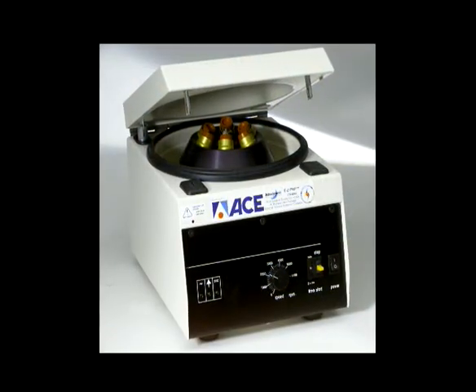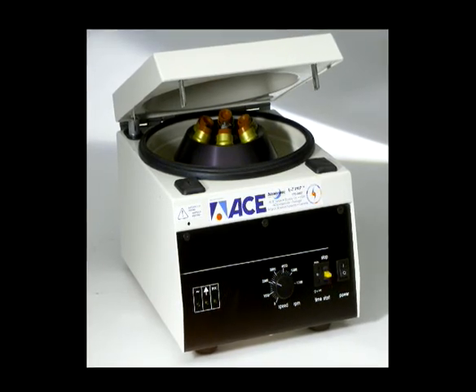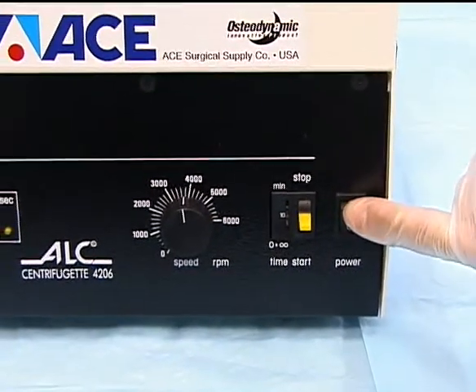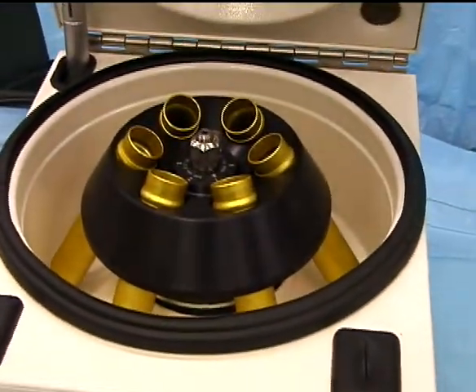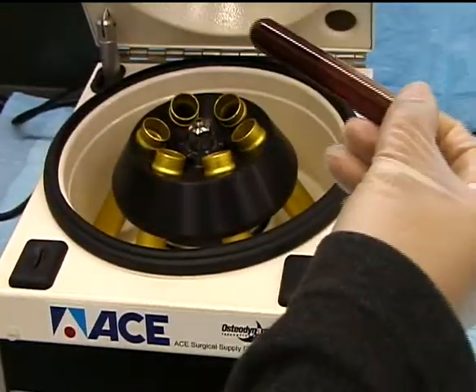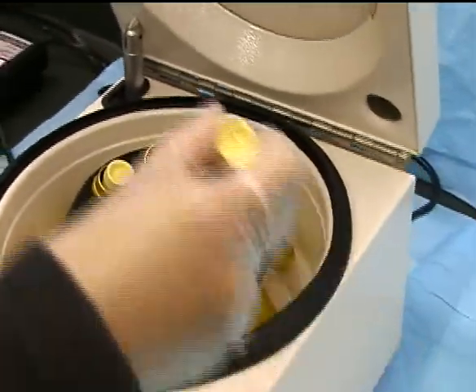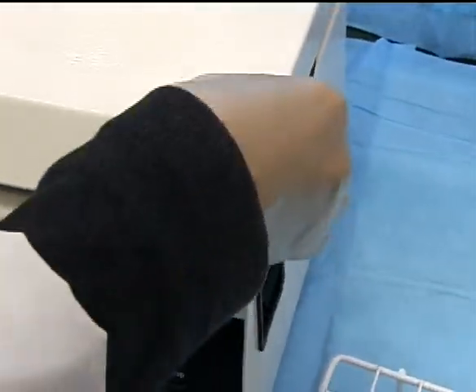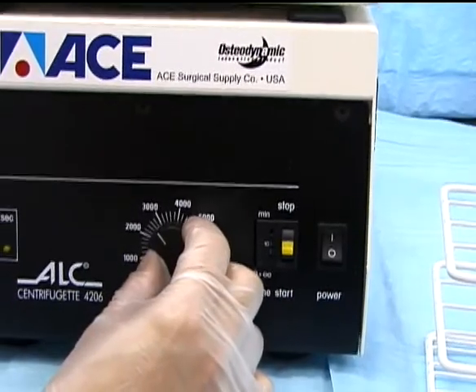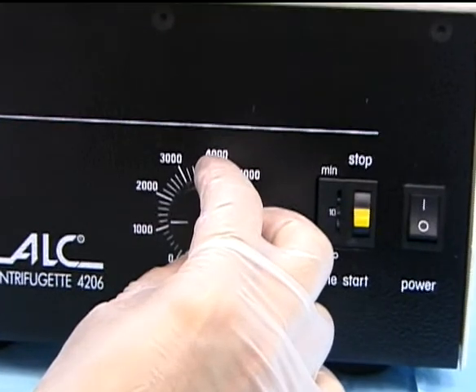The ACE Surgical Centrifuge is constructed so as to permit low spin velocities and g-forces. It is turned on by the switch on the right. The top may then be opened by depressing the lever on the machine's right side. This reveals a six-position angled rotor. The yellow top tubes may now be placed into the rotor. Always ensure that the tubes are counterbalanced as detailed in the centrifuge manual. The centrifuge cover is closed and the dial is set to 1300 RPM for 10 minutes. This will create a relative centrifugal force, or RCF, of 150.